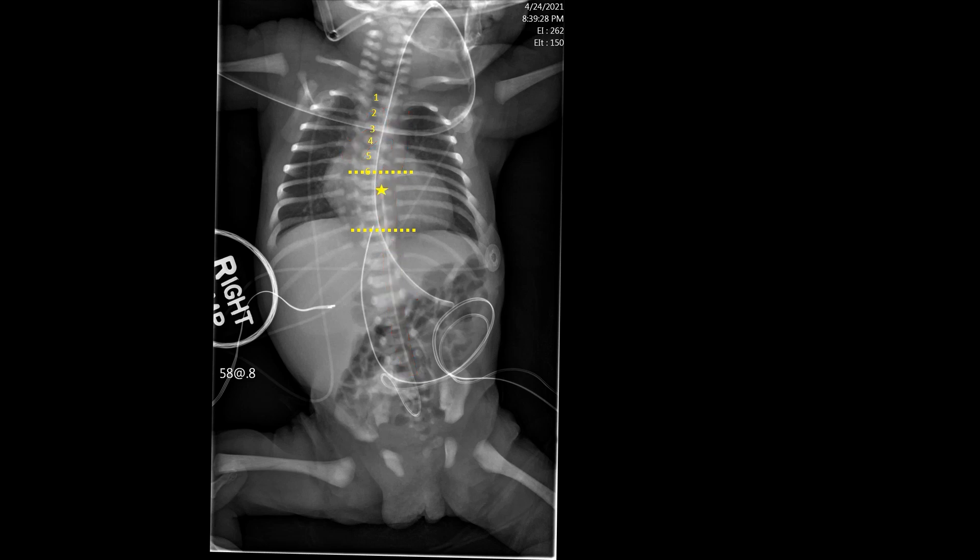We can see that the catheter in this patient is appropriately positioned right at the T7–T8 level, marked here with a star.